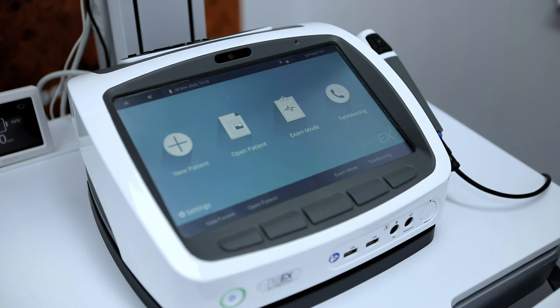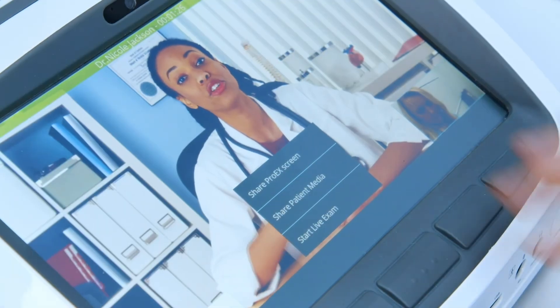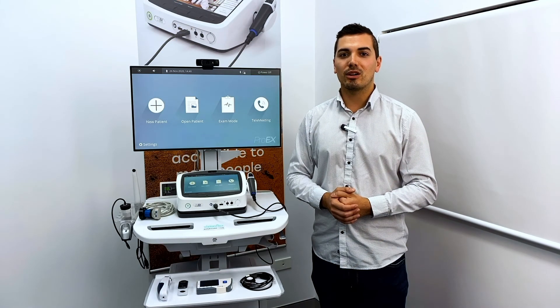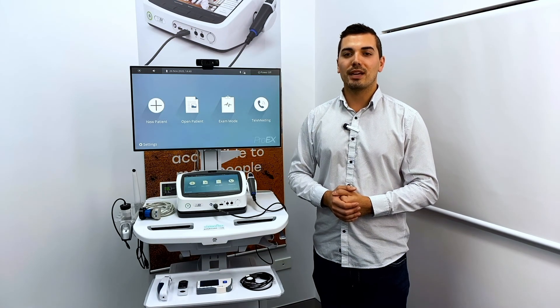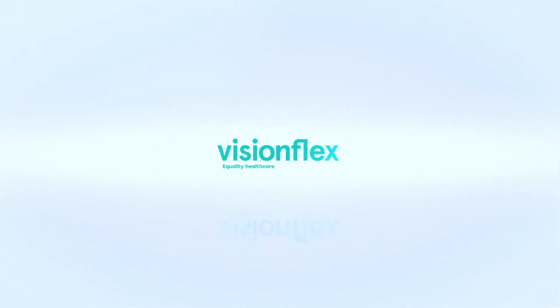Finally, we have our telemeeting tile where we can send a meeting invite to the doctor as well as enter our virtual meeting room where the meeting takes place. For more information on the ProEx Desktop Telehealth Hub, please contact us and visit our website at visionflex.com.au. Thank you.